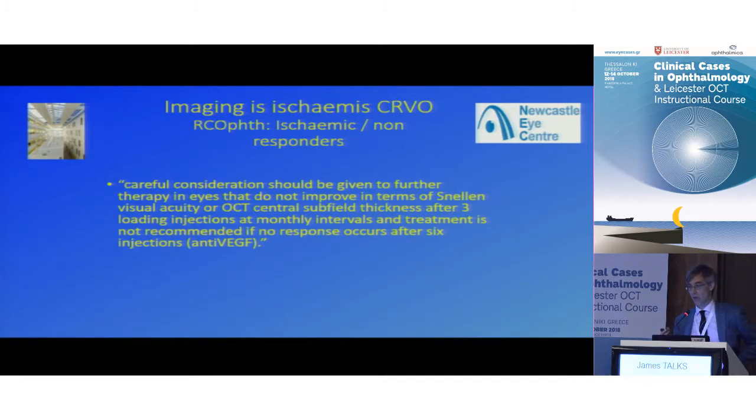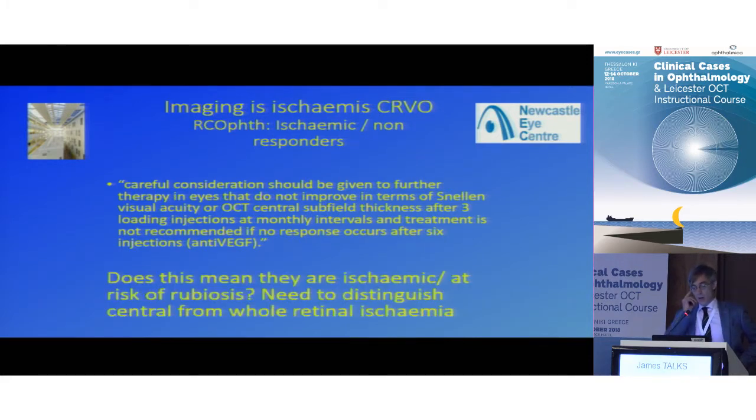Because there is no vision cutoff in our practice. Our NICE guidance says, macular edema for central retinal vein occlusion, you can treat them. Doesn't matter what the vision is. So should we just treat them? Is that going to work? So I'm going to try and address some of those issues.